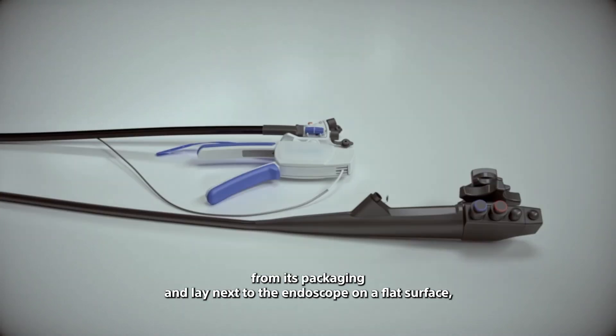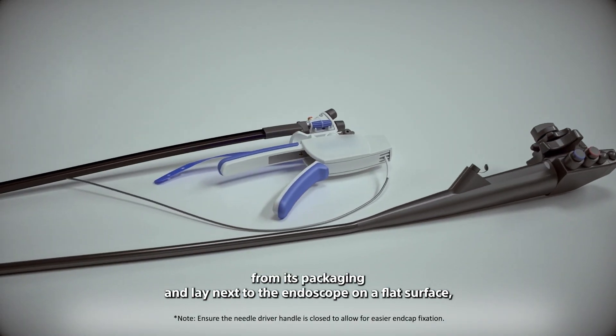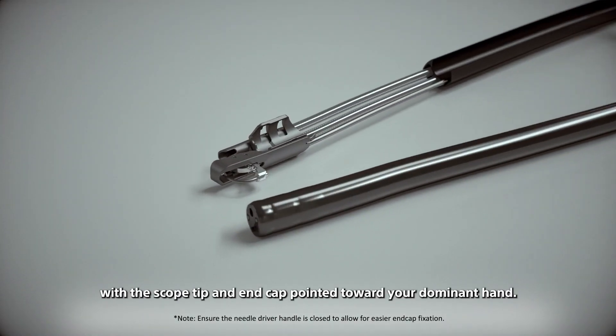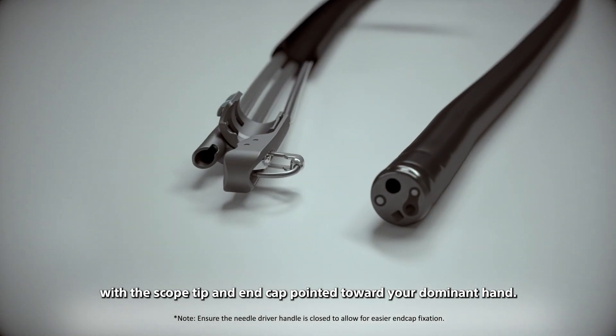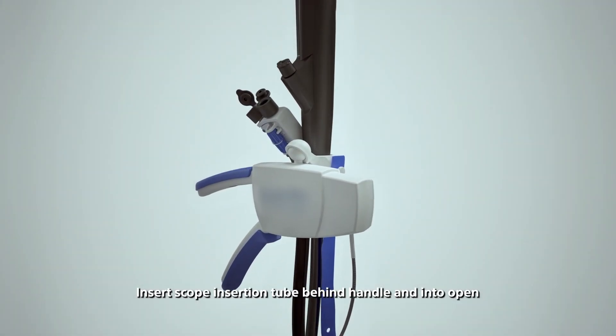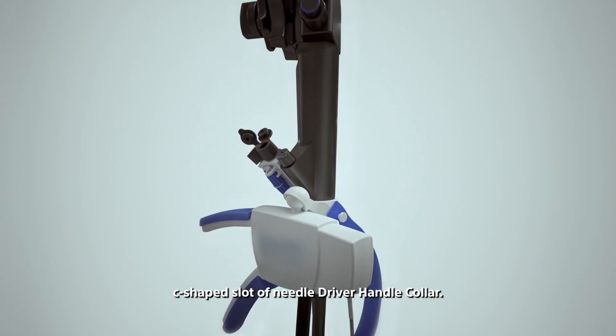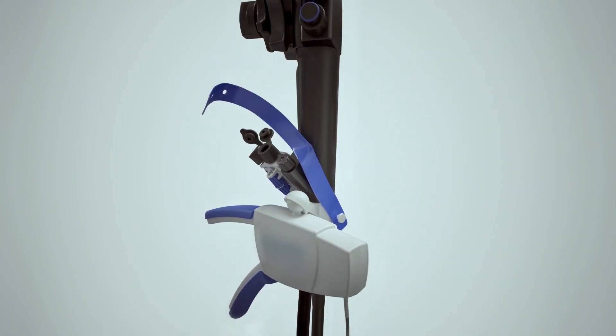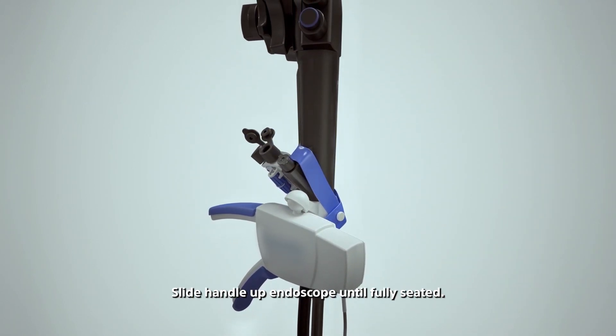Remove the needle driver handle from its packaging and lay next to the endoscope on a flat surface with the scope tip and end cap pointed toward your dominant hand. Insert scope insertion tube behind handle and into open c-shaped slot of needle driver handle collar. Slide handle up endoscope until fully seated.